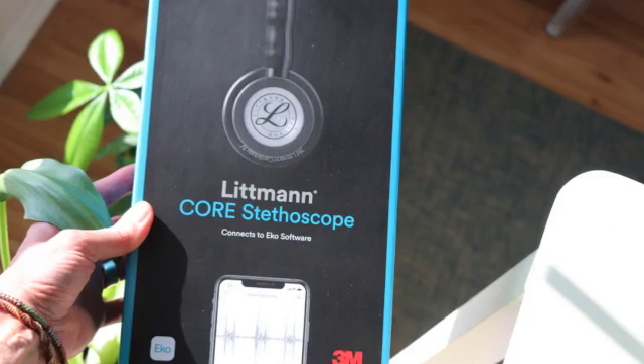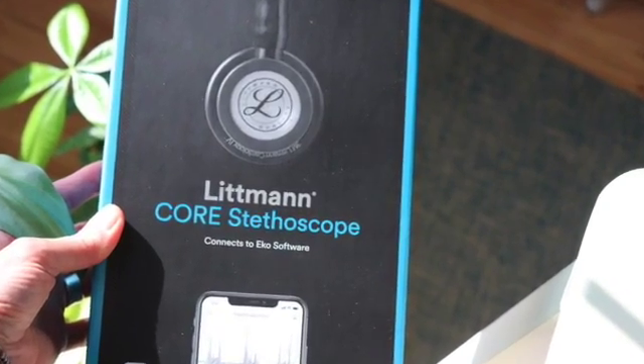I'm coming back on set to tell you that I goofed. I'm going to keep it transparent and just keep this video going. In the last video I talked about the Littmann Core stethoscope and I was completely wrong — and that's okay because I'm human and technology is always changing. So let's go ahead and re-review the Littmann Core stethoscope.